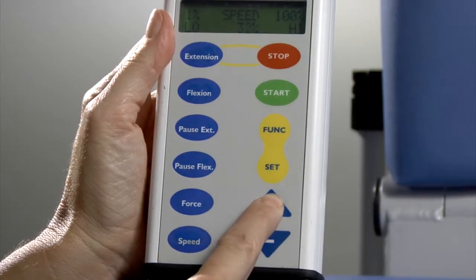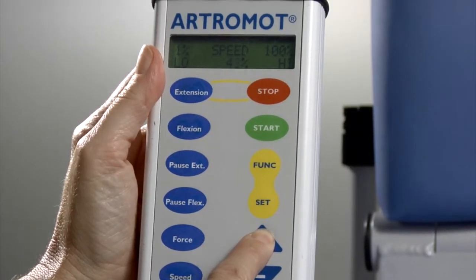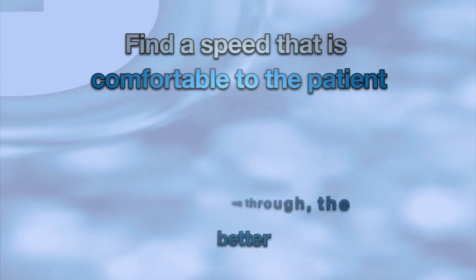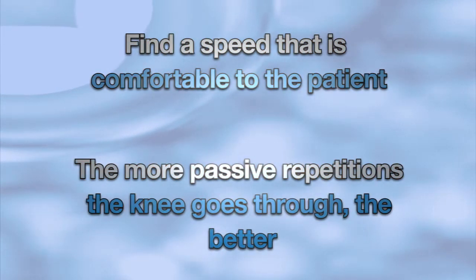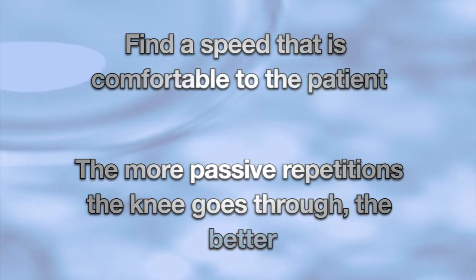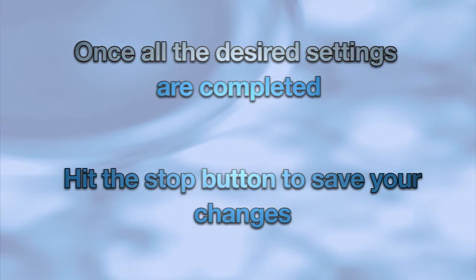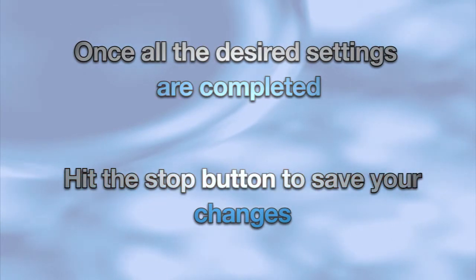Up arrow to make the machine move faster, down arrow to make the machine move slower. Find a speed that is comfortable for the patient, keeping in mind that the more passive repetitions the knee goes through, the better. Once all of the desired settings are completed, hit the stop button. This will save the changes that you just made.